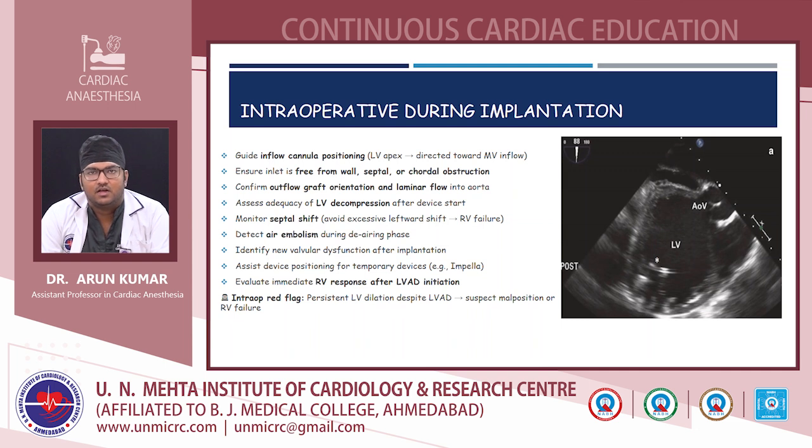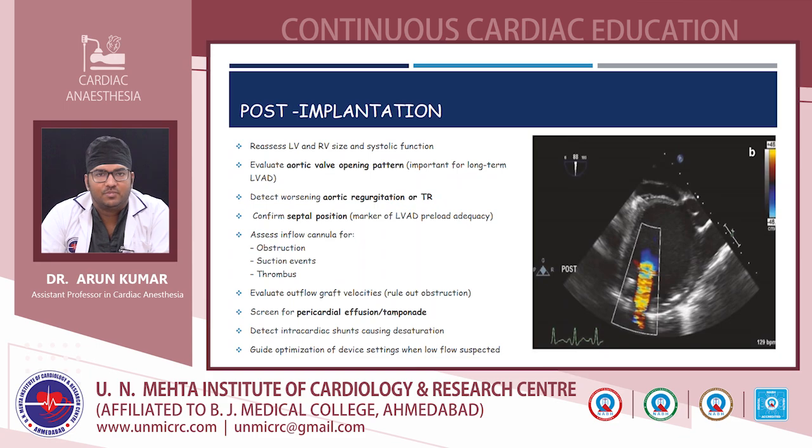So this is a mid-esophageal LV long axis view showing a post-implantation LVAD. After implantation of LVAD, we are supposed to reassess the LV and RV size and systolic function. We are supposed to evaluate the aortic valve opening pattern, and also detect any worsening AR or TR.